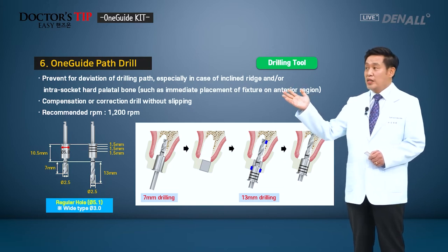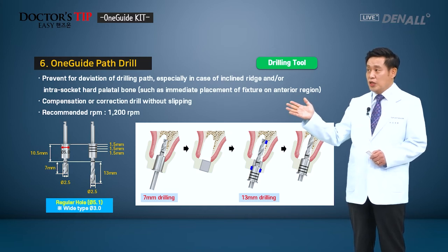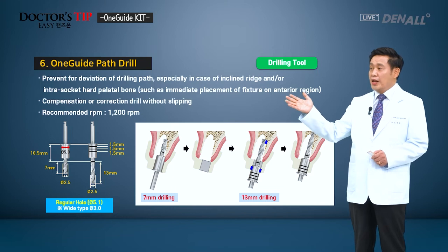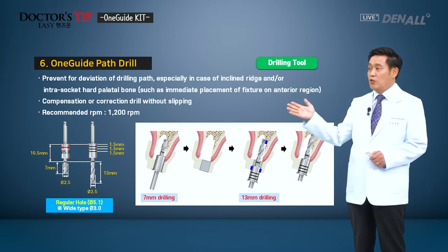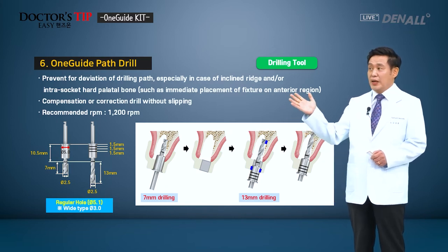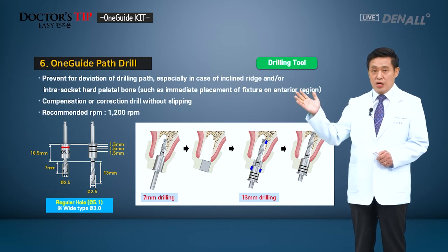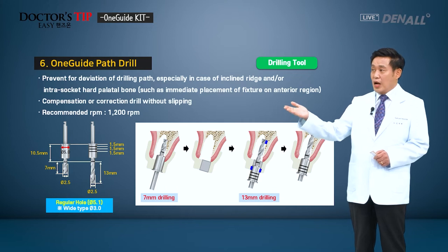Next is the OneGuide Path Drill. The OneGuide Path Drill, unlike the flattening drill, is for the upper anterior. In the upper anterior on the socket towards the palatal, the bone is harder, so the OneGuide drill can slip slightly. In those cases, if you create a drilling path, you can remove deviation, and that is the path drill.